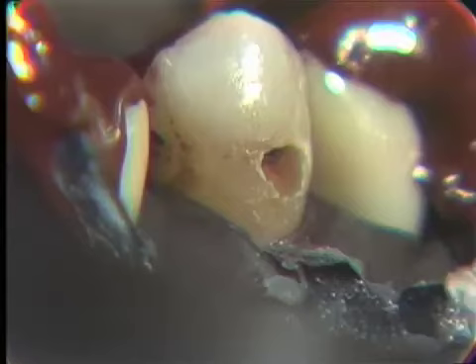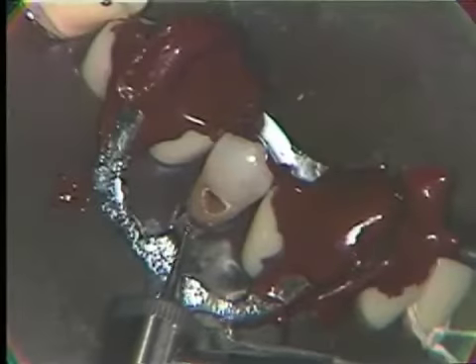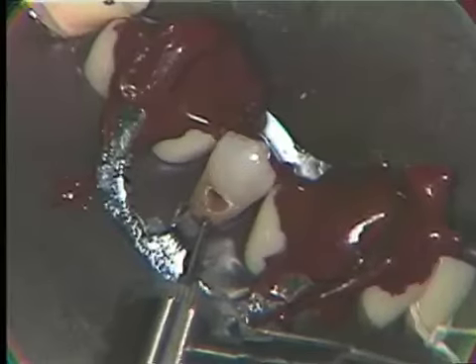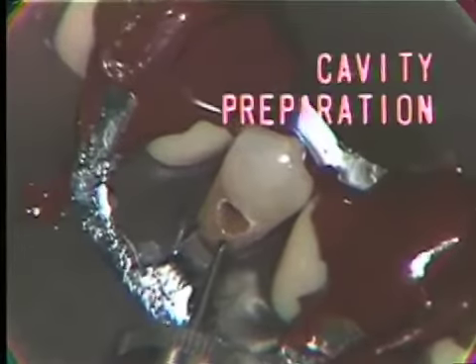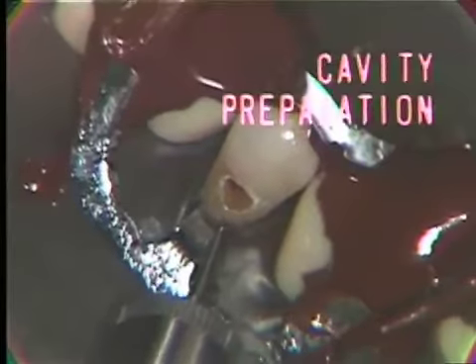After we penetrate with the round bur, then we will extend, and then we will refine our cavity preparation, put our retention in, and we suspect that the depth of the decay will cause us to put a zinc phosphate cement base in. So we will begin to make our first cut, applying our round bur at the surface of the carious area, and make a penetration with our water spray, keeping the tooth cool and carrying away the debris.